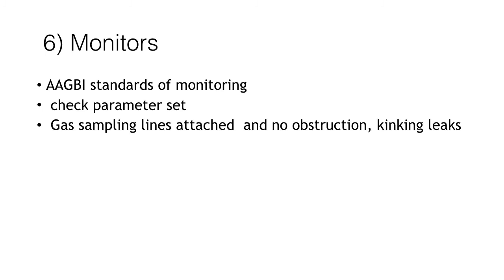So in addition to checking the whole of the anaesthetic machine and its connections, it's also important to check that our patient monitors are working correctly. The AAGBI set out standards of monitoring, so there are separate guidelines for this, the AAGBI's standards of monitoring during anaesthesia and recovery guidelines, which I have put a link to at the end of this lecture, which discusses which monitors are essential during the induction and maintenance and recovery of anaesthesia.